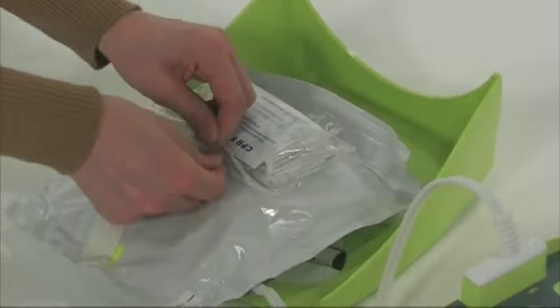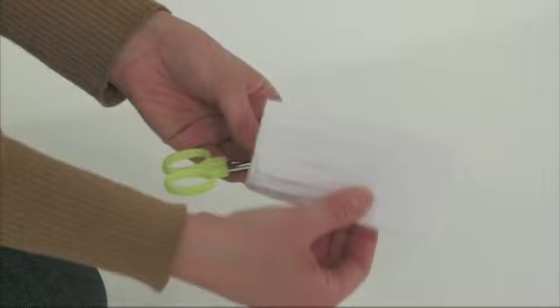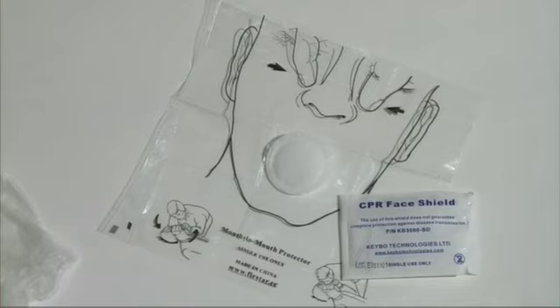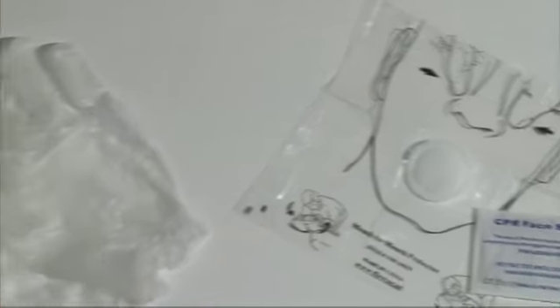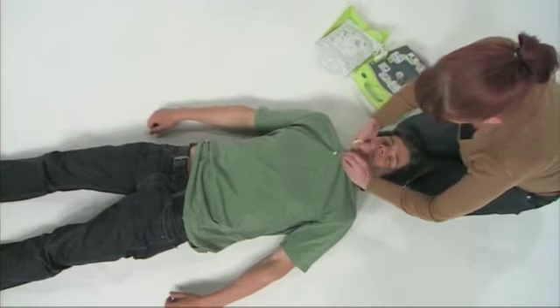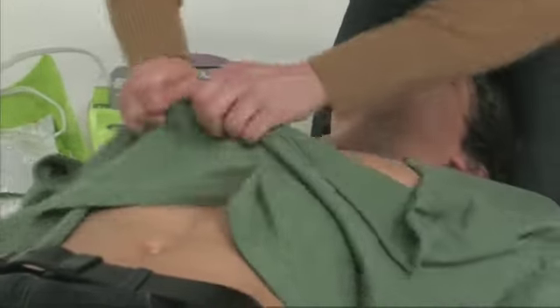Attached to the electrodes pack is a first responder kit. This includes a razor, a small towel to dry the patient's skin, and scissors for cutting clothing. A disposable face shield and gloves are also supplied for your protection. The electrodes need to be placed directly onto bare skin, so first remove all clothing covering the patient's chest.